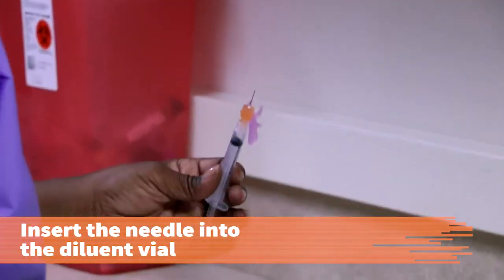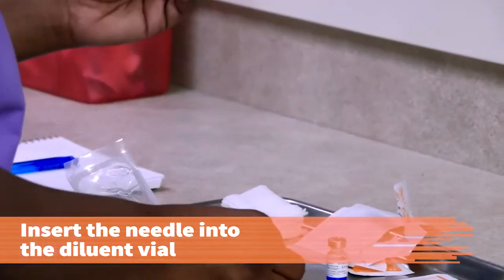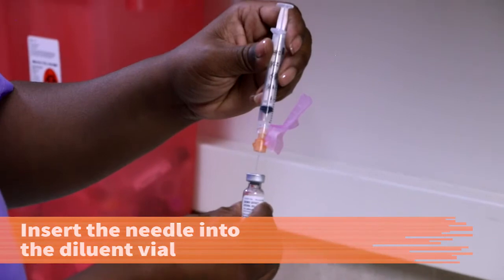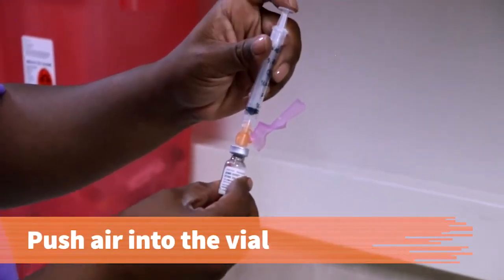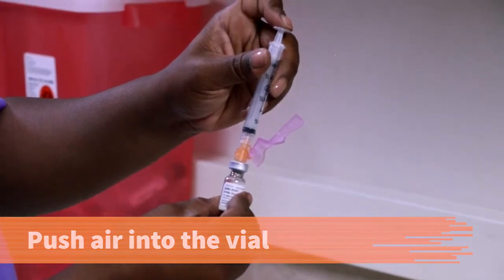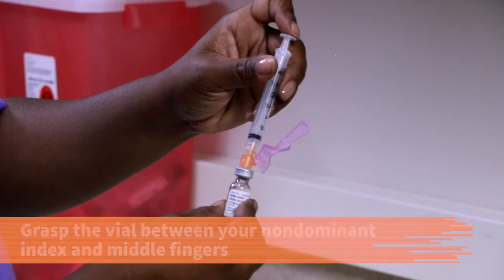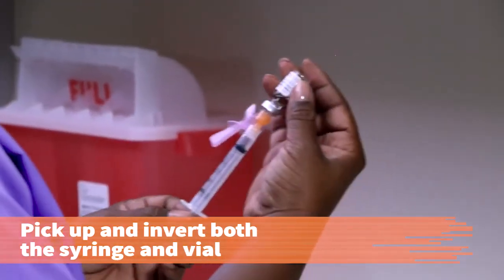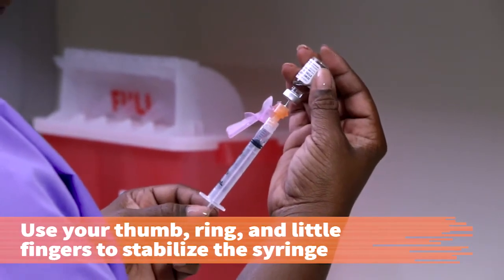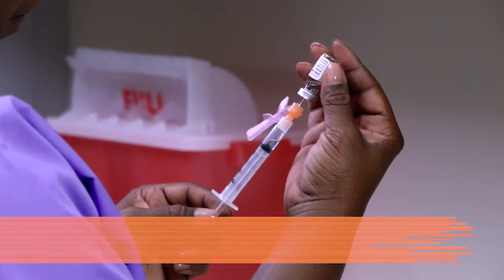Using the syringe with the aspirated air equal to the amount of diluent needed, insert the needle into the center of the rubber stopper of the diluent vial. Make sure the needle is not in the fluid. Push the air into the vial, but do not force the air into the vial. With the palm of your non-dominant hand facing upward, grasp the vial between your middle and index finger. Keeping the syringe unit in the vial, pick up and invert both the syringe unit and vial. Use your thumb, ring, and little fingers of your non-dominant hand to stabilize the syringe in the vial.